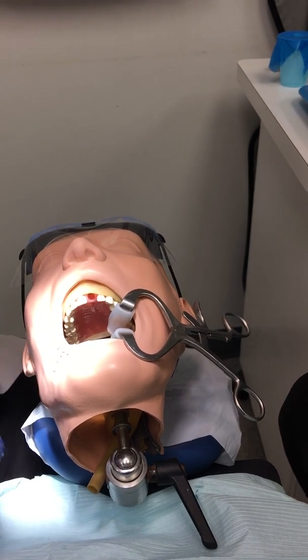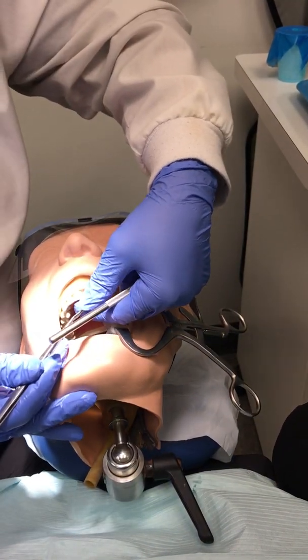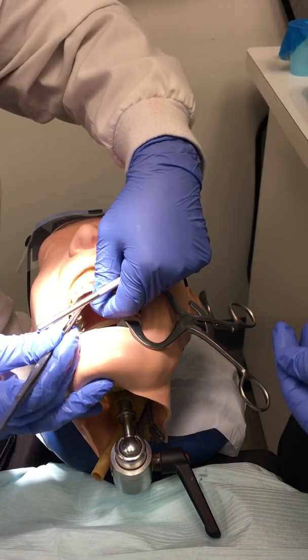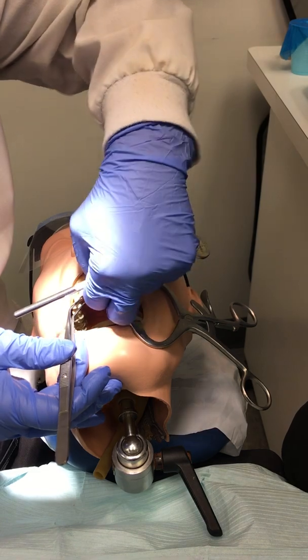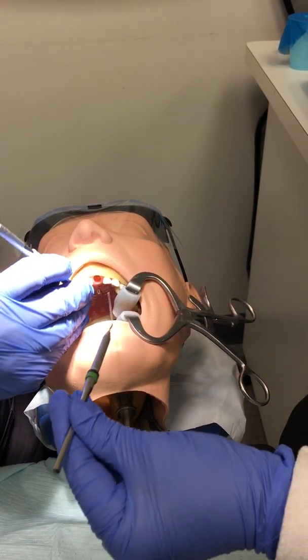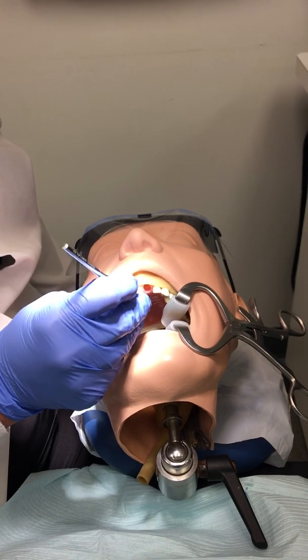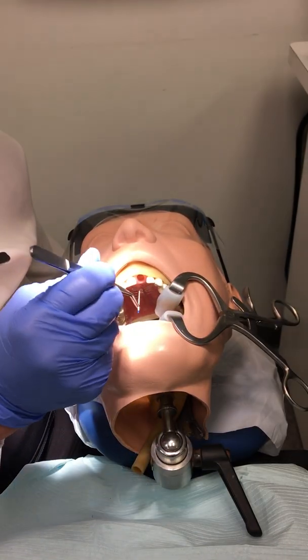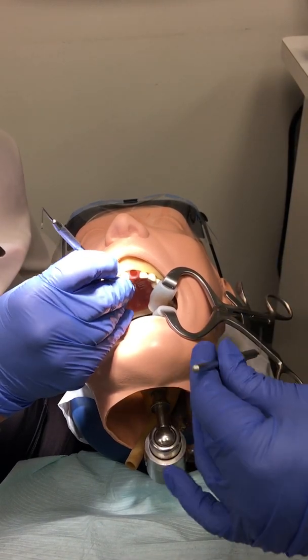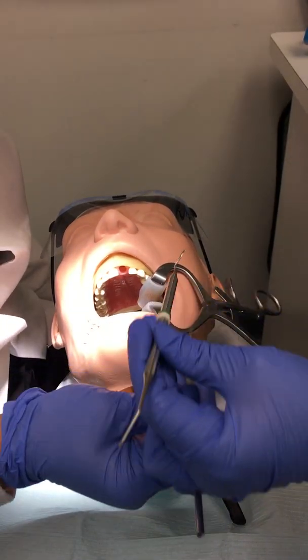Now it is time to fill. Pass the doctor the master cone using locking cotton forceps. The doctor will measure the gutta-percha, then use a heat source to place it in the canal. Transfer the condenser to help condense the gutta-percha. Have the spreader ready — the dental assistant will transfer back and forth between the condenser and the spreader, passing accessory gutta-percha points to help fill the canals. Pass the glick to the doctor; the doctor will heat it to remove extra gutta-percha and make room for a temporary filling.